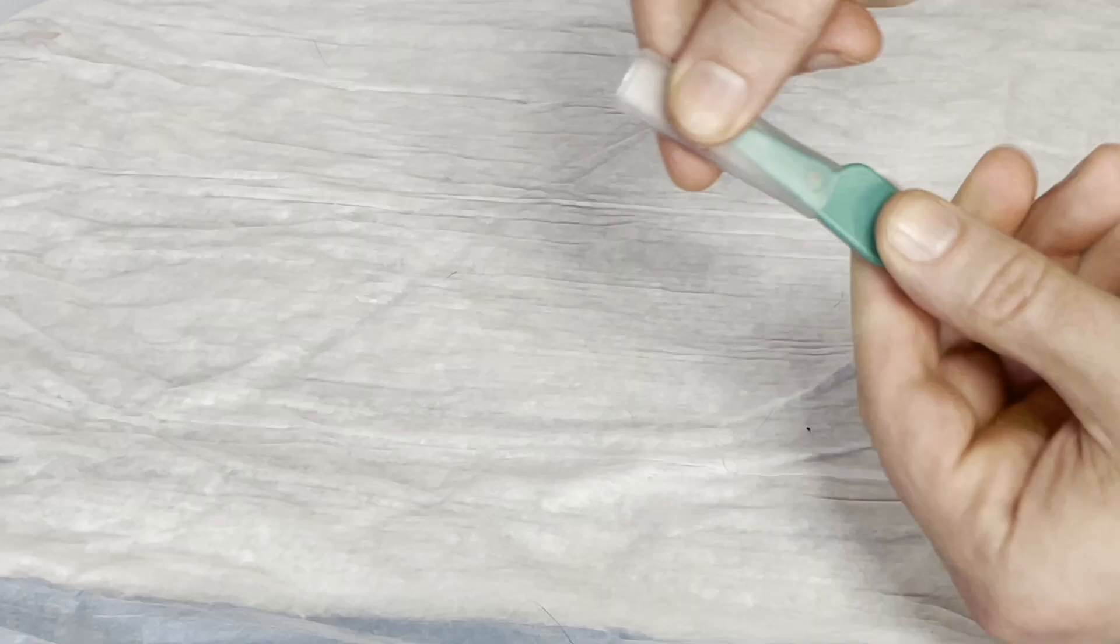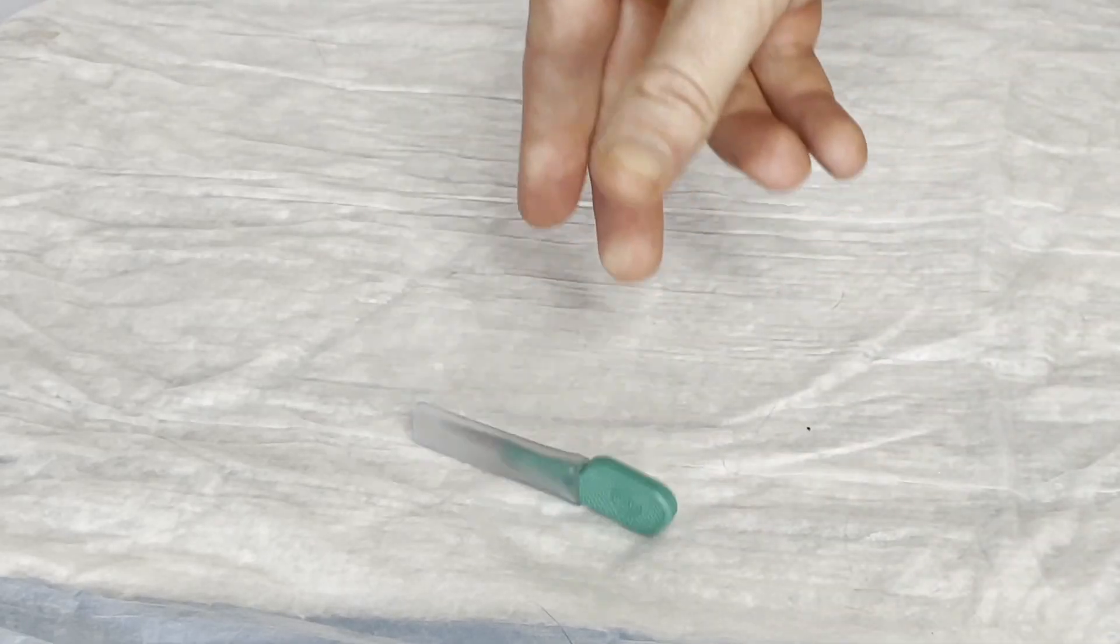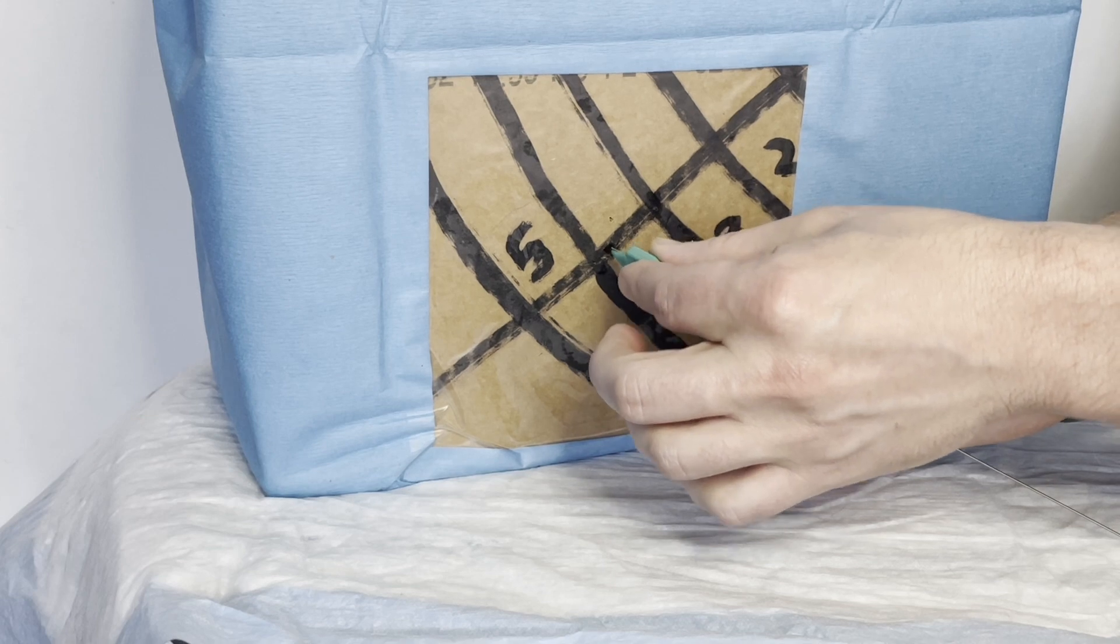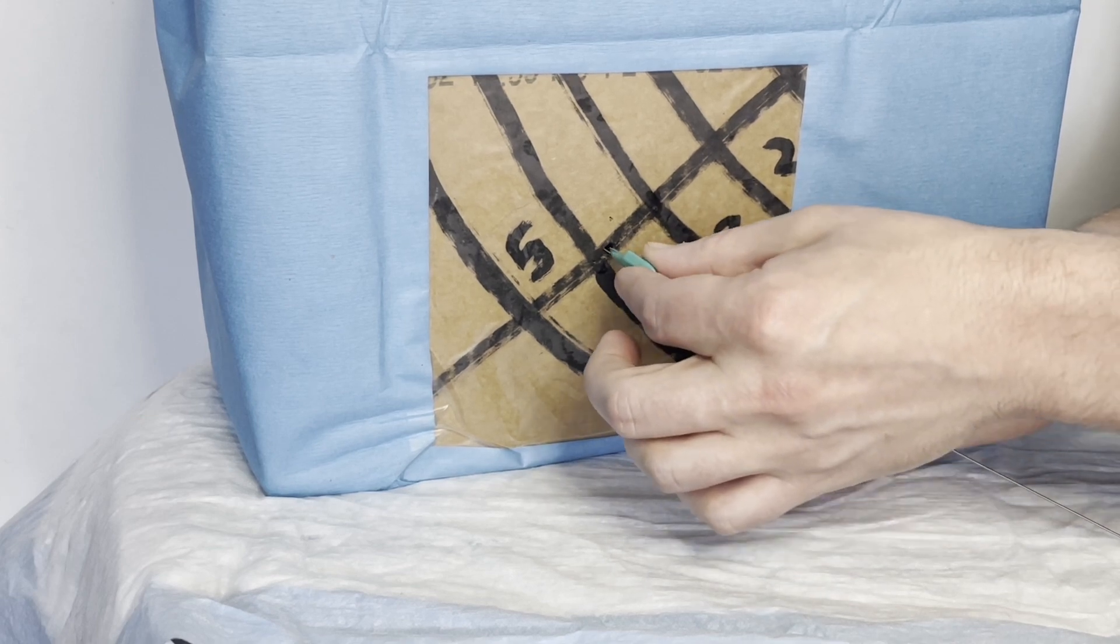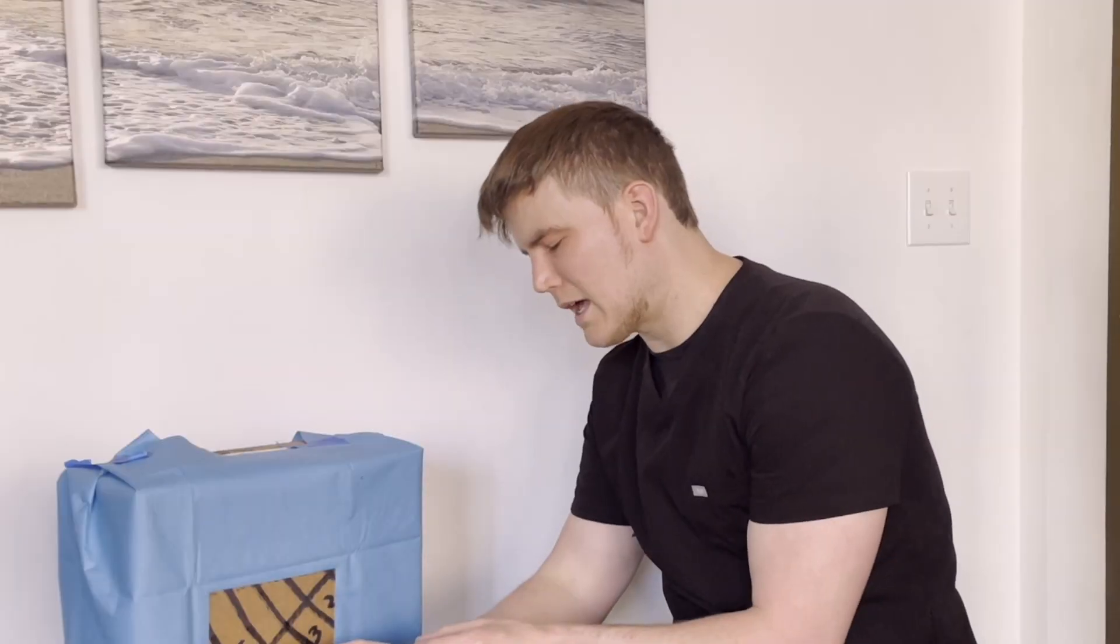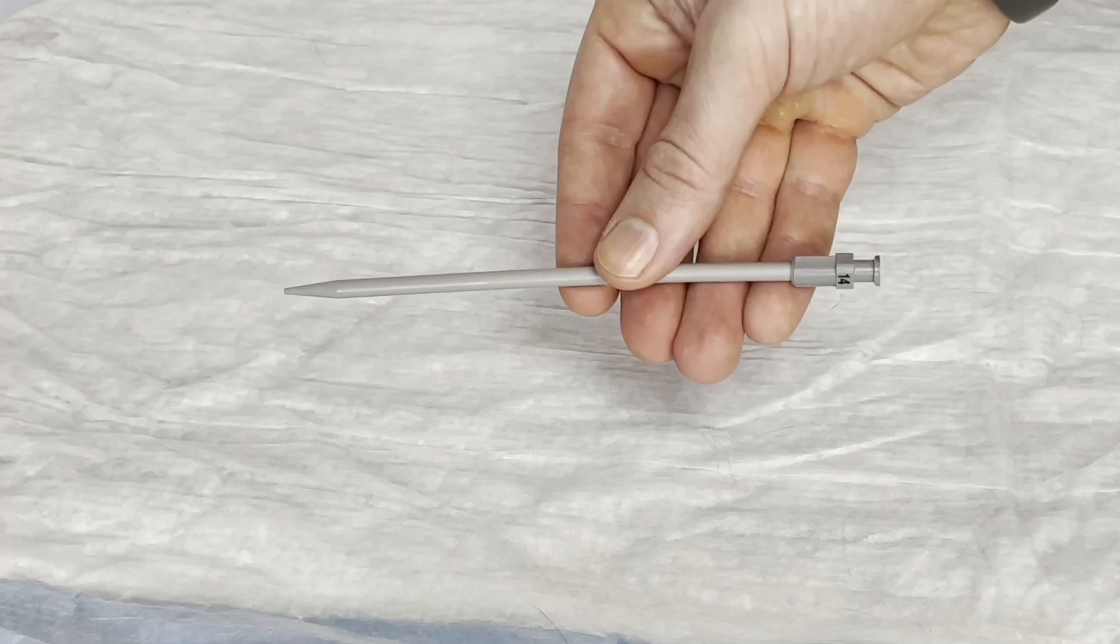Next up we have an 11 blade scalpel. We want to make a stab-like incision. We're going to invert the needle and we're going to push it along the guide wire here to make a nice stab incision.